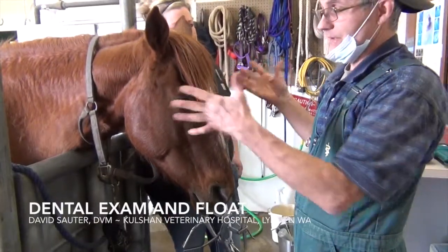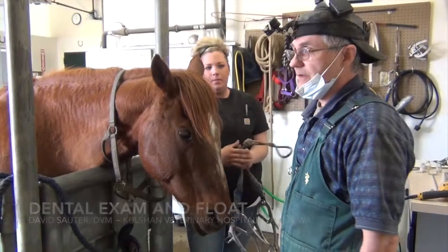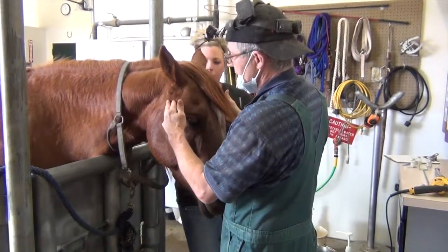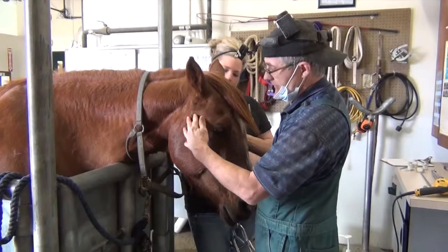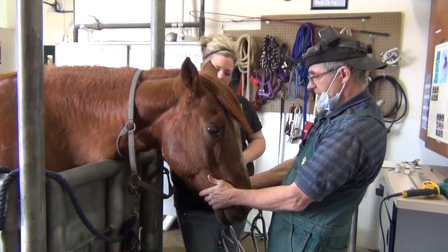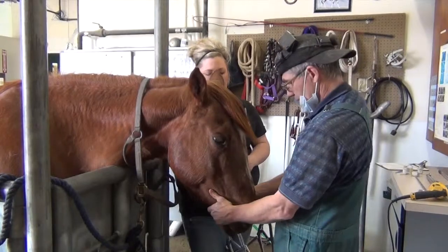at the clinic because we have the stocks and we have everything set up just right. But we can also do this in the field, in a barn situation, in like a box stall, which works pretty well. Before starting with an oral exam, I'm just going to do an external exam of her head and make sure everything looks normal, that there's good symmetry between the two sides of her face, and I don't see anything structurally wrong with her head.